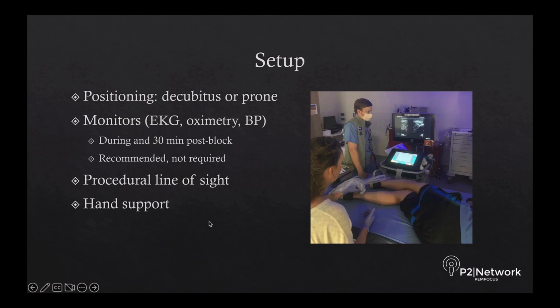It's good practice to have your patients on monitors anytime you're doing a block. When you're doing a smaller single nerve peripheral block, it's reasonable to be off monitors. You definitely want to have patients on monitors if you're doing a larger field block, as this is a higher risk for LAST and other complications. That being said, it is our practice to have patients on monitors even for single blocks.